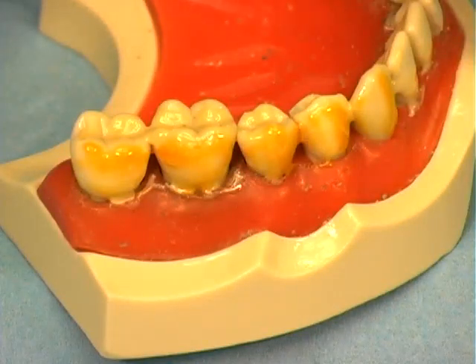Instruct the patient that the teeth may have a yellow or clear temporary film on the tooth surface, depending on the manufacturer's product used. The varnish should be left undisturbed in order to provide the greatest therapeutic results to the treated areas.